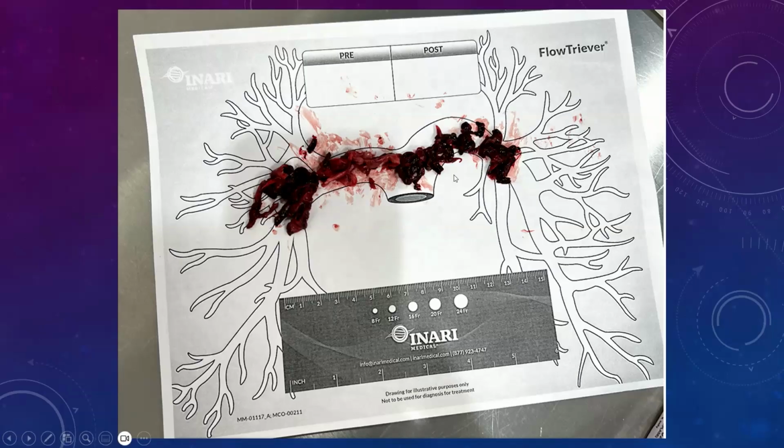Red stuff is generally going to be your acute PE. White stuff is going to be some chronic. So she had a degree of chronic PE going on, which I didn't show one of those images. But after we had aspirated a lot of this clot, I was still able to see, it almost looked like aortic atherosclerosis, but within the right pulmonary artery, where you just see stuff stuck up against the arterial wall. So she had some chronic PEs, but she clearly had a massive acute saddle pulmonary embolism that should have killed her.